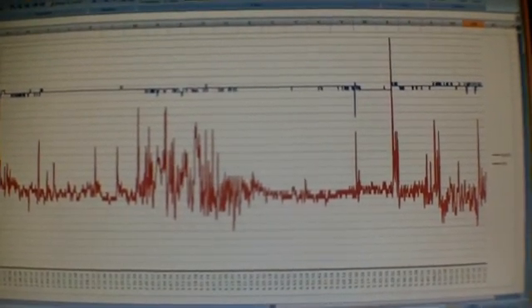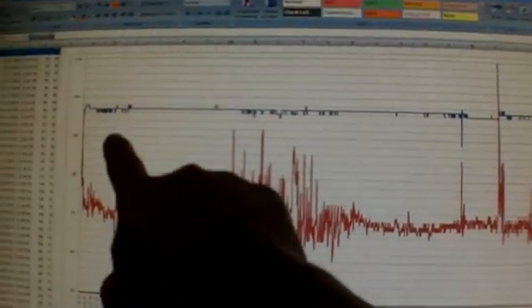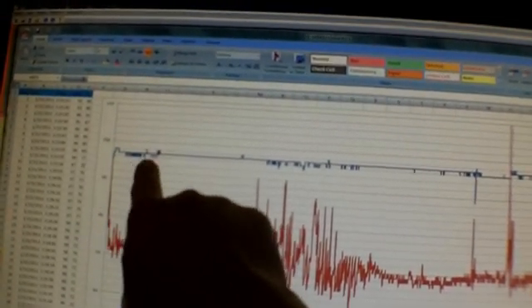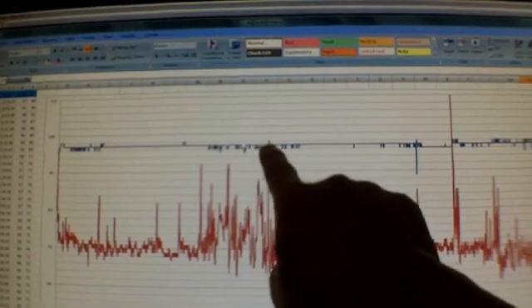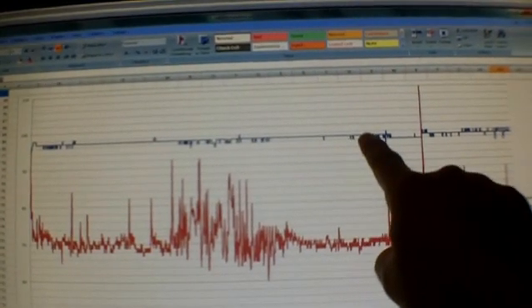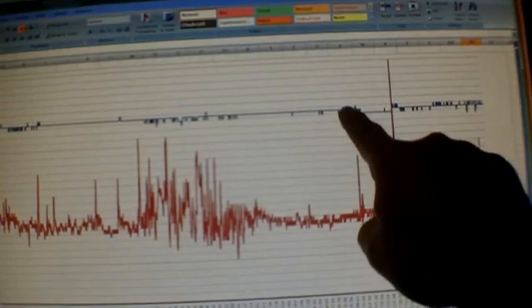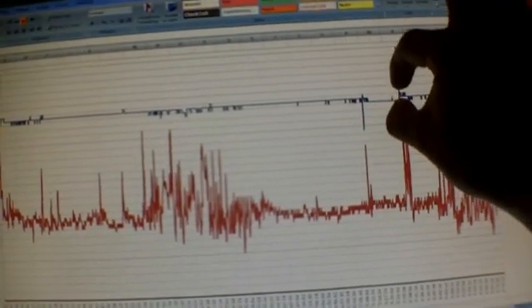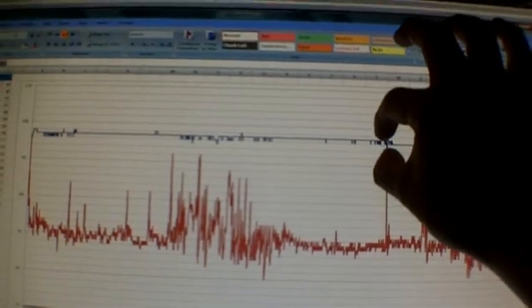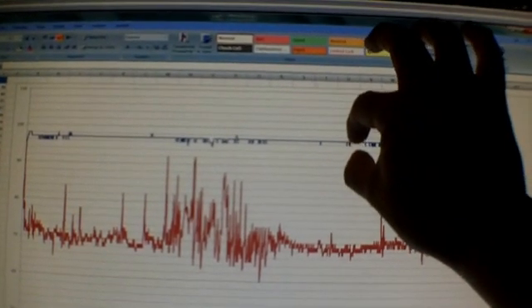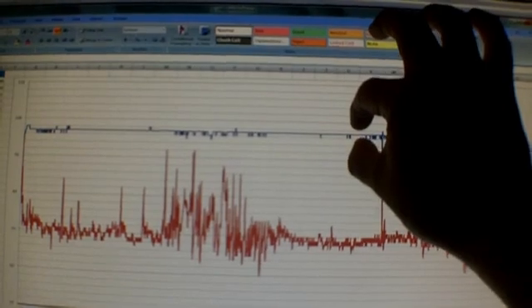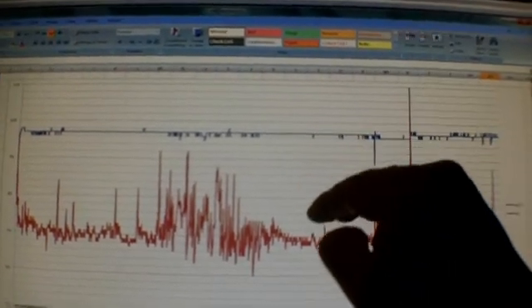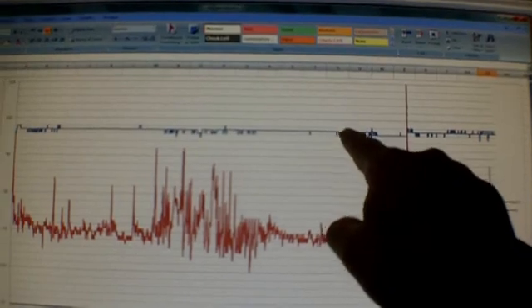With the CPAP mask, as you can tell, the oxygen level, you know there's a little bit of a peak and dip, but nowhere near the level before. Here there's one dip and it pretty much stays within the 97 to 98% range as opposed to the other one which dropped into the 80s.